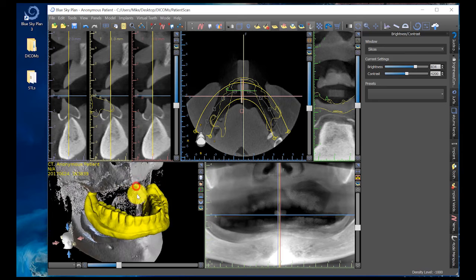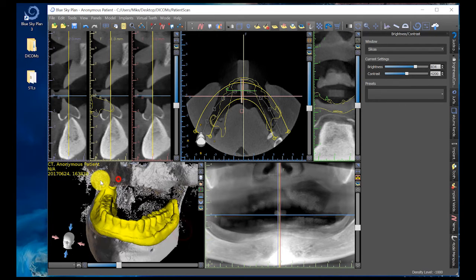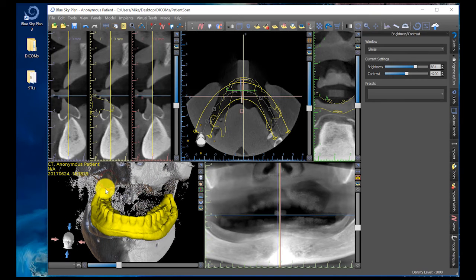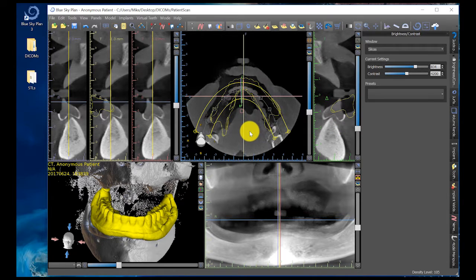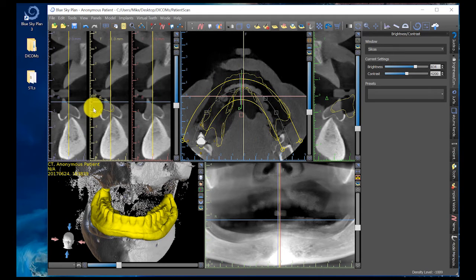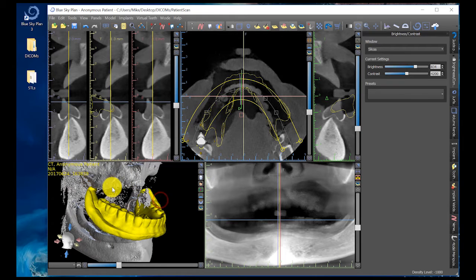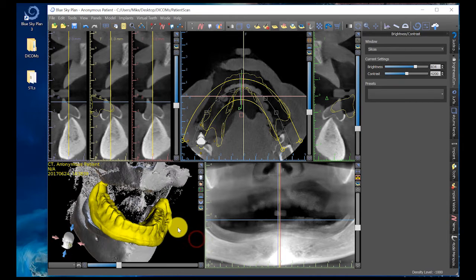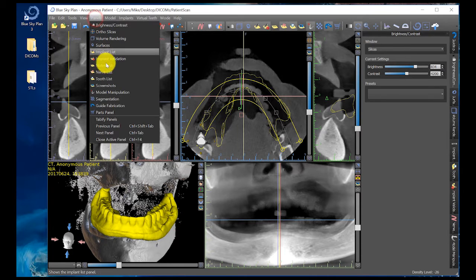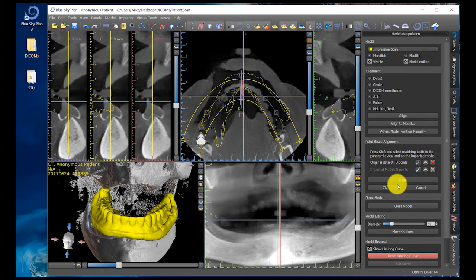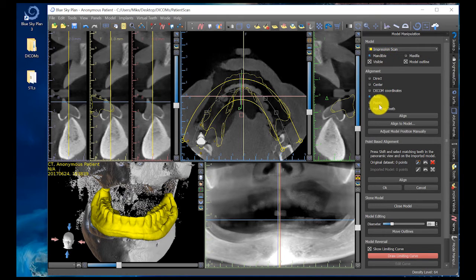Looking at the bottom left-hand corner of the screen, you're going to see our patient scan and our denture scan. Also getting familiar with the Blue Sky Plan software, you can see the yellow outlines on all the different portions showing where the outline of my model is. My goal is to now merge this second scan — the radio opaque PVS in the denture — so that it's in the exact same position as the patient scan. To do that, click on Panels, Model Manipulation. Make sure you click the drop-down, Impression Scan, Mandible is selected, and click on Points.